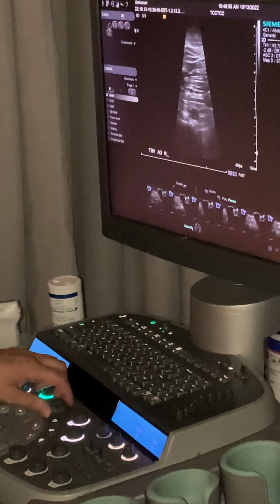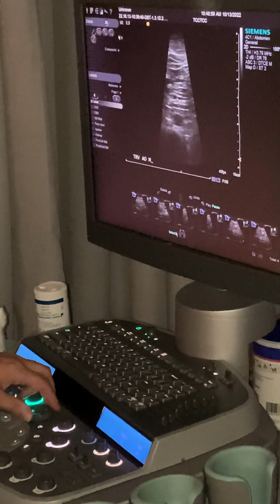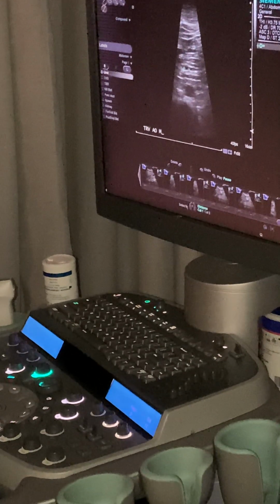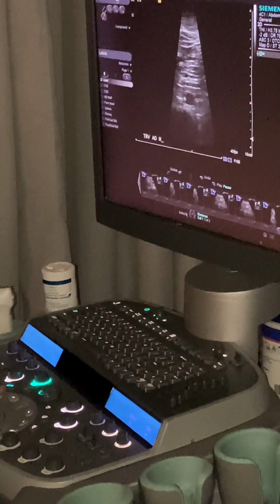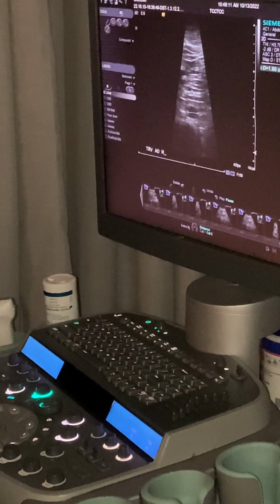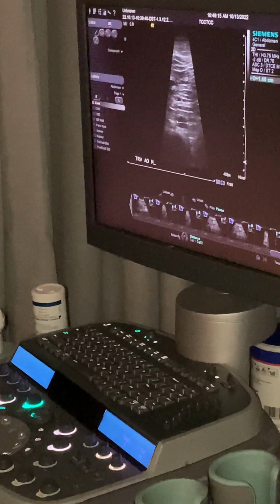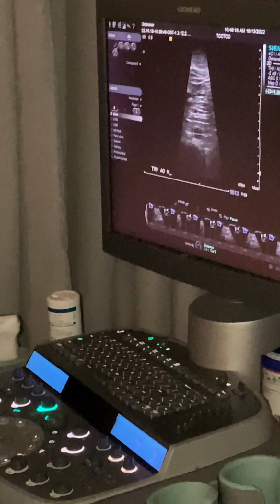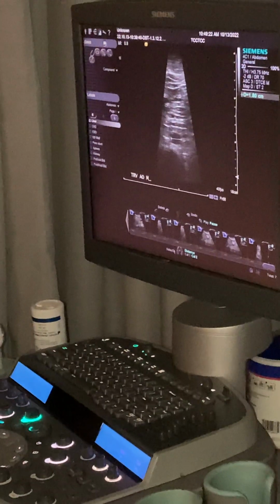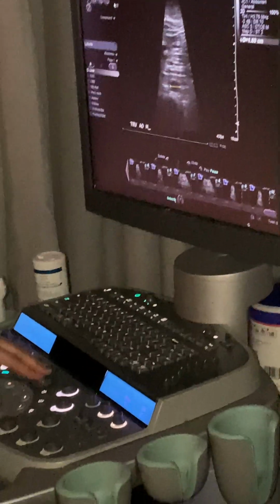Here we go. Walls aren't quite as clean as they were at the prox. We just didn't have that nice clean window that we had with the proximal, so we're just going to use our best guess. How did you deal with the gas? Push. You just push. In transverse, I went over to the right and scanned over, and when we were in sag with the mid, I just pushed, and you can just wait it out. Okay, who's next on our list?